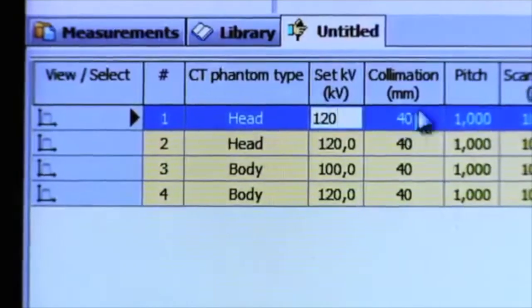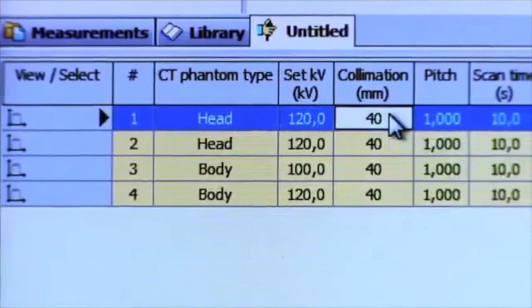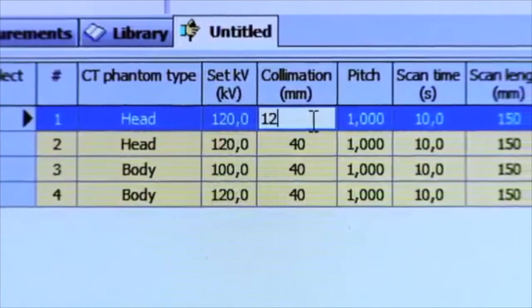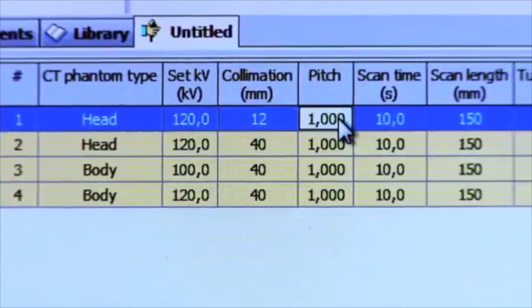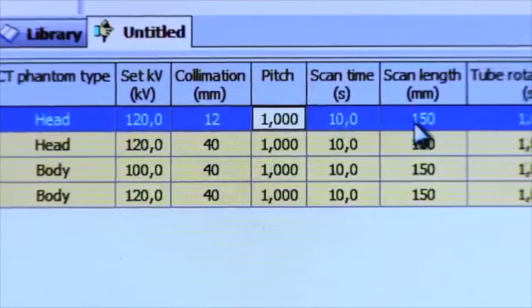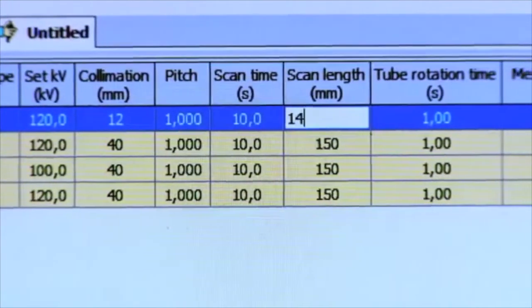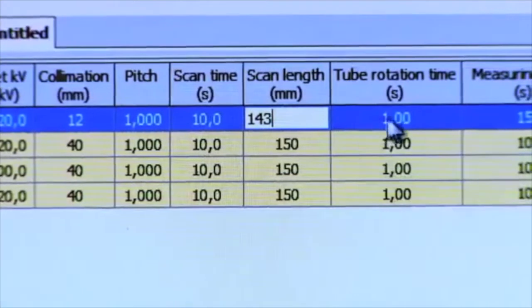Kilovolt. Collimation—this is the thickness of the total detector area used in the CT. Sometimes you have to calculate the thickness yourself. Pitch. Scan length—this parameter must be added to get the dose length product.